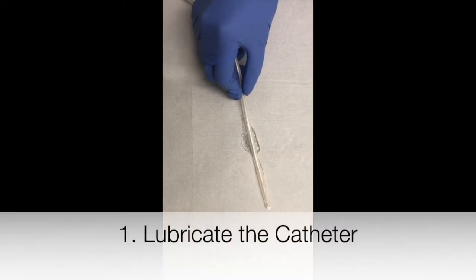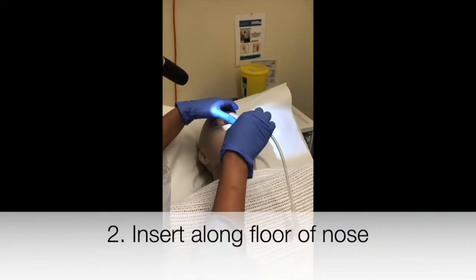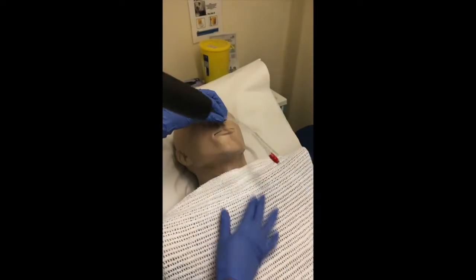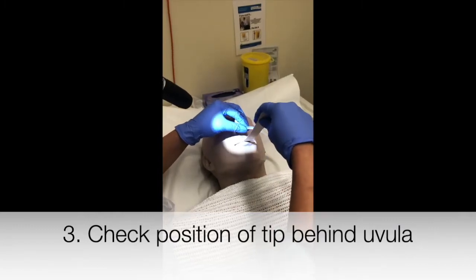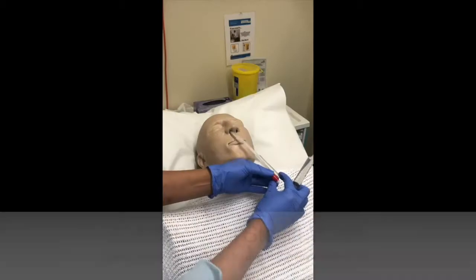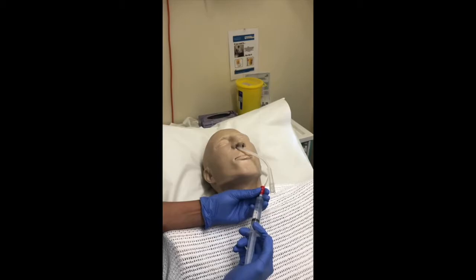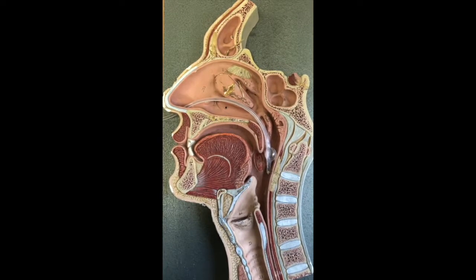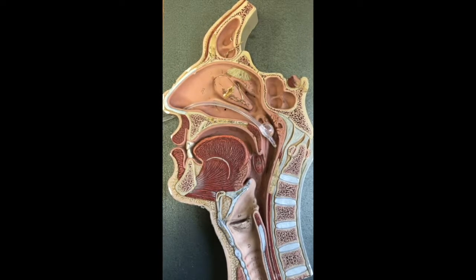Lubricate the catheter and insert it along the floor of the nose. Check the position of the tip behind the uvula. Inflate the catheter with sterile water, watching the balloon inflating in the patient's oropharynx as you do this. Then bring the balloon forward to tamponade the bleed.